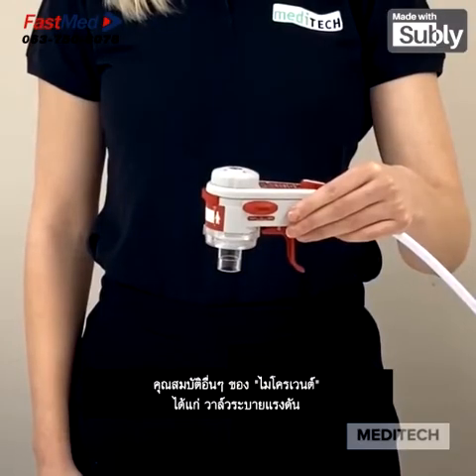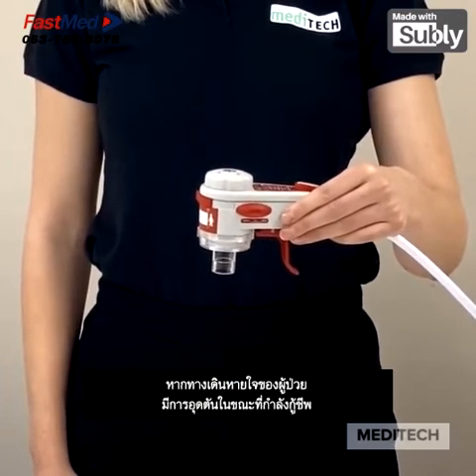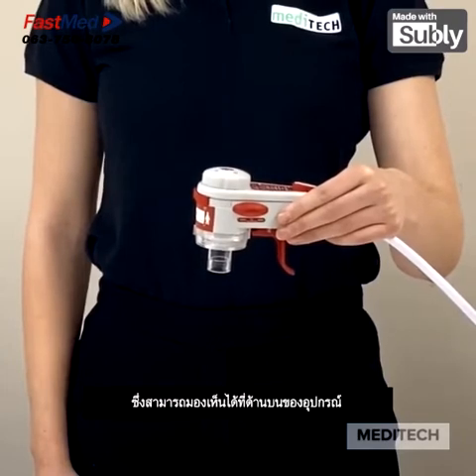Another feature of the Microvent includes a pressure relief valve. This gives an audible warning should there be a blockage within the patient's airway whilst they are being resuscitated. This can be seen on the top of the device.